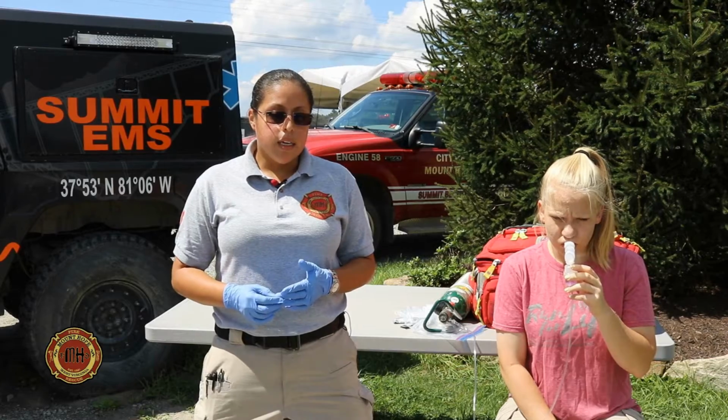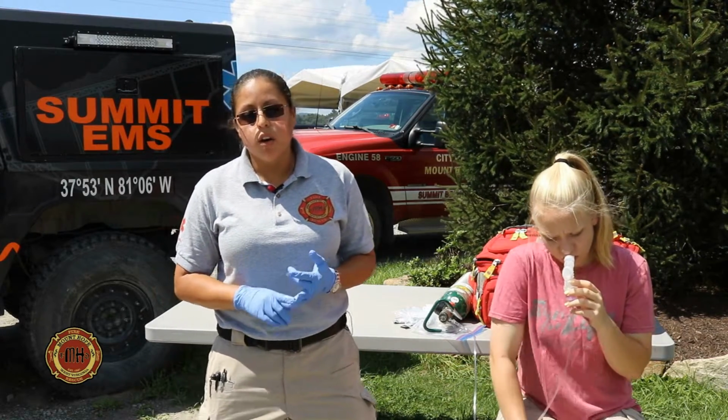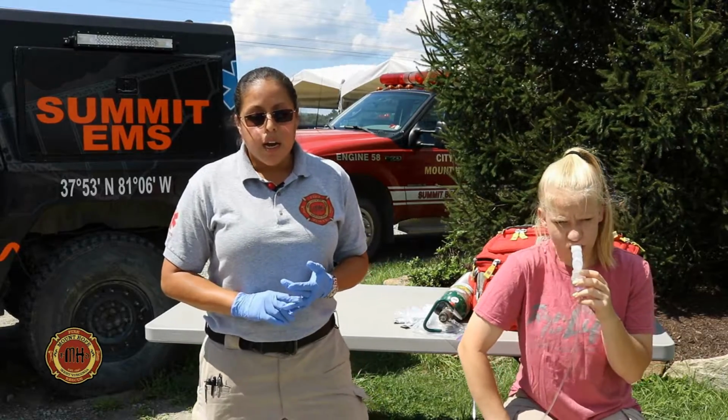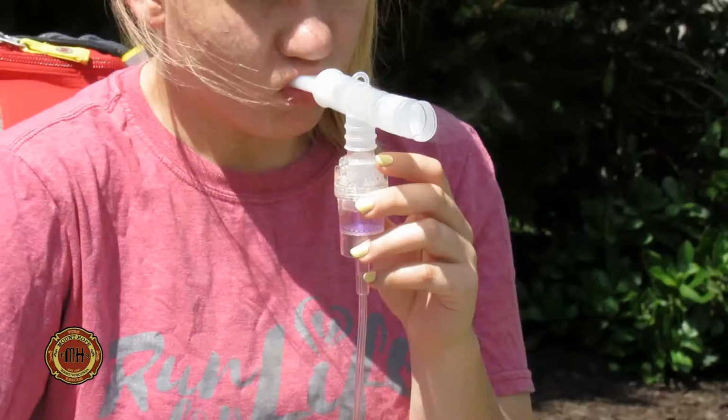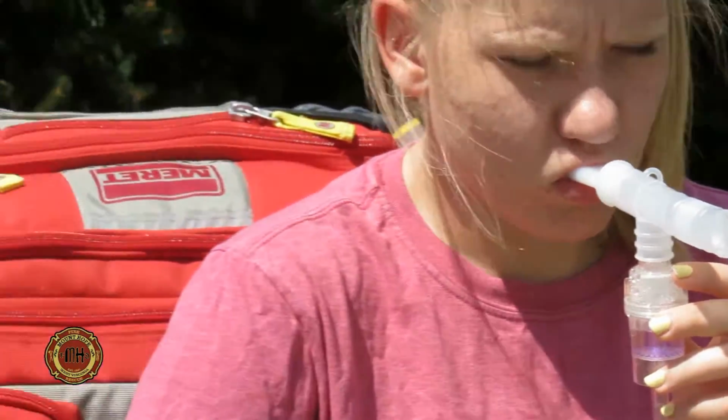As long as they're not showing any signs of chest pain or cardiac distress, you can consider CPAP. If they do start showing those signs, make sure you stop the treatment and start treating them according to the protocol for the symptoms that they're exhibiting. And you can contact MedCom for any kind of further instructions.